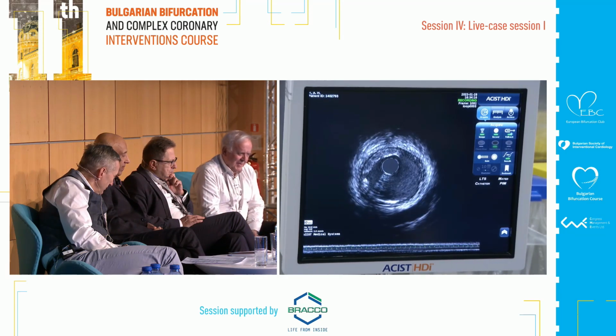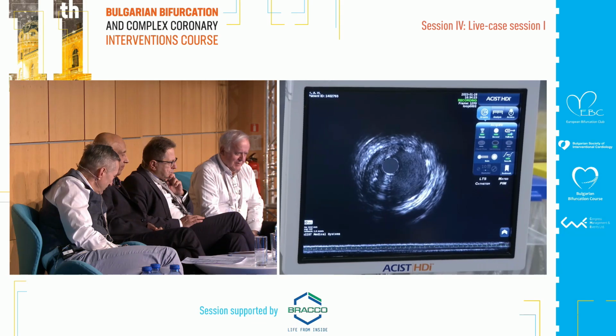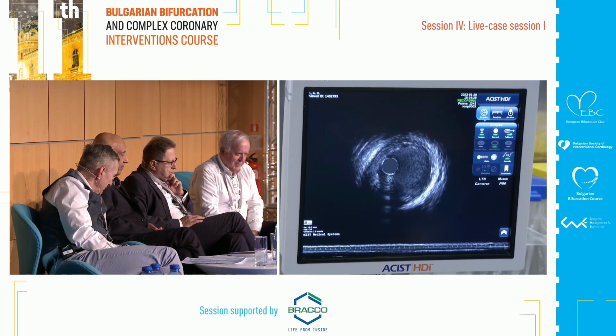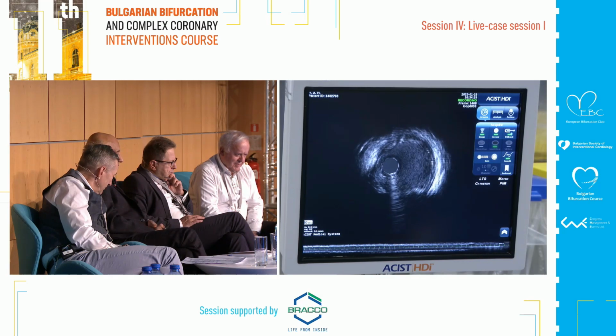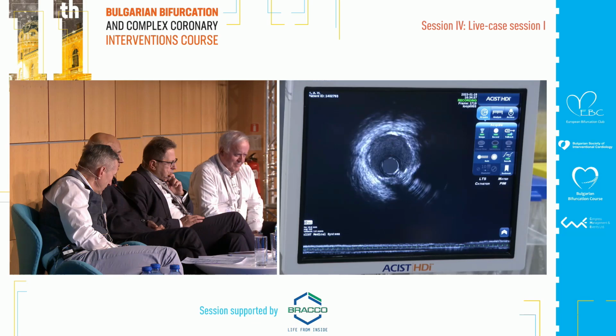Okay, are you putting it back? I think this may be old because it looks like there's some of the older material inside the stent. Okay, yeah, still old stent, not much neointima. Yeah, at 9 o'clock there is some. Okay, still old stent, we don't see 2 layers. Here, this is old. This is old. Yeah.